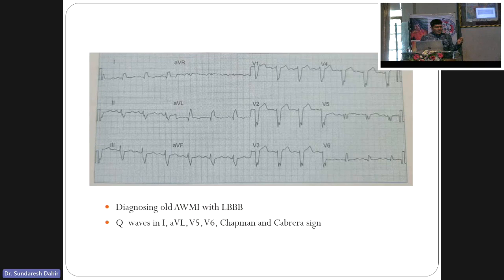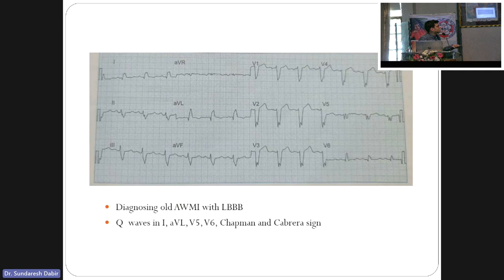In old MI with LBBB, to identify a prior MI: look for Q waves in I and aVL, and notching in the upslope of the S wave — called the Cabrera sign. If there is notching in the upstroke of the R wave, it is called the Chapman sign. These are pointers that the patient had MI previously. This is a huge topic and I think I have taken much of the time. Thank you.